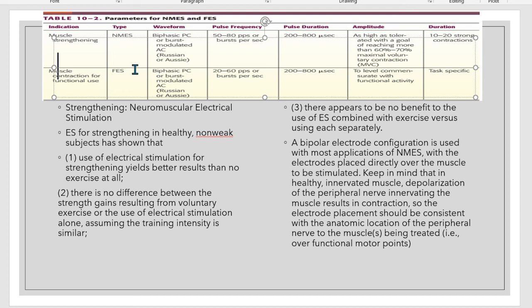So tag 10 siya: 10 sa abductors, 10 sa lumbricals, 10 sa interossei. So isa na siya ka swift, isa ka agi, 10, then ibalik nimo another 10, so until magka 60. Pila man siya kabalik? Six, no? Tag 10, 10. So ihapon nimo 1, 2, 3, 4, one set. Sunod na, one set na ni siya sa muscle, ibalik na sad nimo, you return again, no?